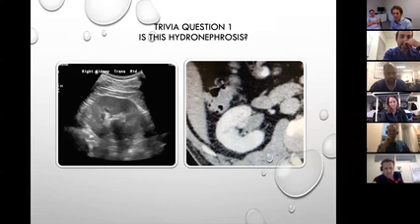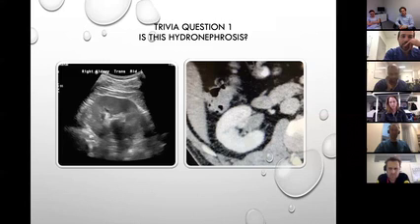The pain was on the left side. This thing was on the right side. So luckily it was on the opposite side, so I didn't call it hydronephrosis. If it is on the same side, I would be quite inclined to get some kind of imaging done. This guy eventually ended up having a CT because the left side had a problem, but that's a different thing. But we didn't call that a right-sided hydronephrosis because it didn't clinically match.